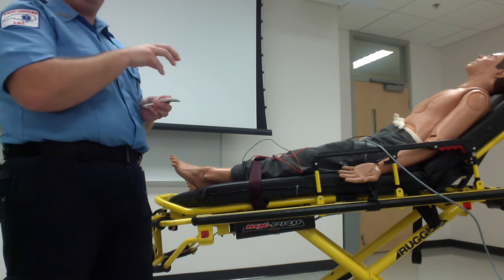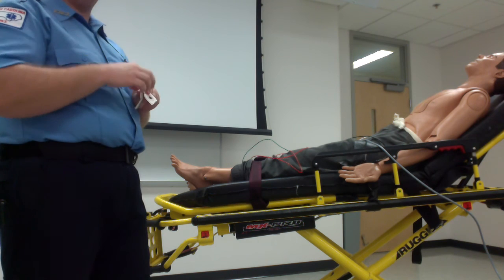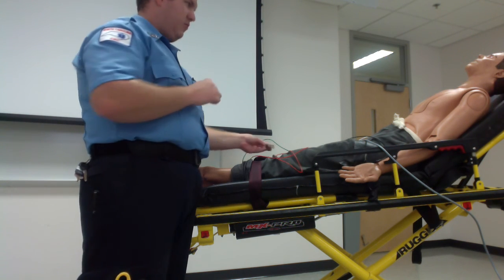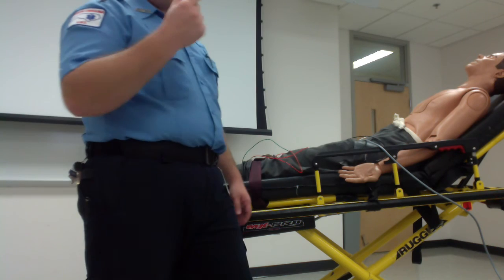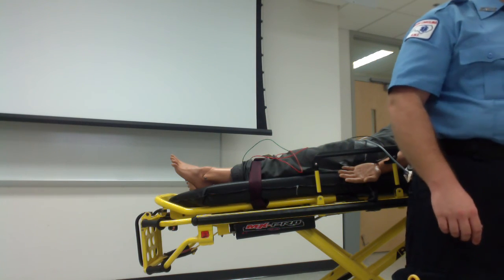First of all, they won't stick to the patient as well. And secondly, the gel itself will dry out, and you won't be able to get a good reading on your patient. You'll have a lot of static, or in some cases you won't even pick up the electrical conduction that gives you your reading.